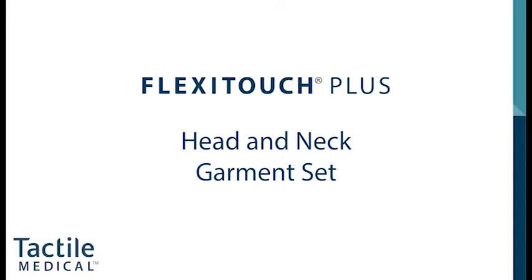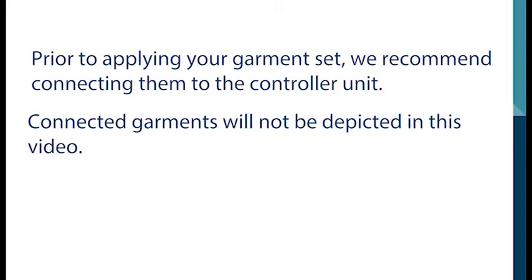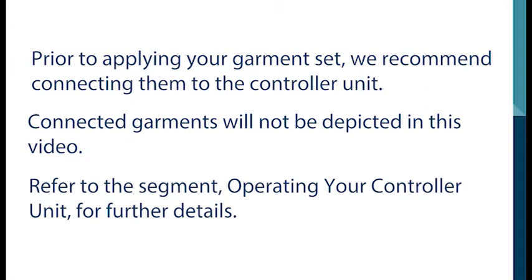In this section, you will learn how to put on the FlexiTouch Plus garments for treatment of the head and neck. Prior to applying your garment set, we recommend connecting them to the controller unit. Connected garments will not be depicted in this video. Refer to the segment, Operating your controller unit, for further details.